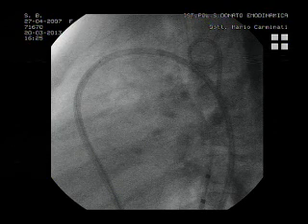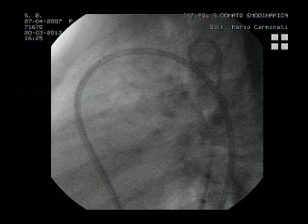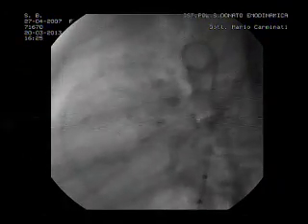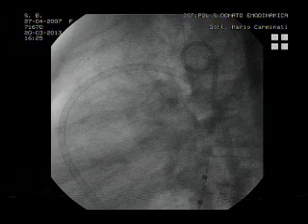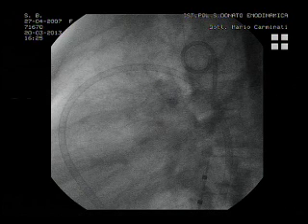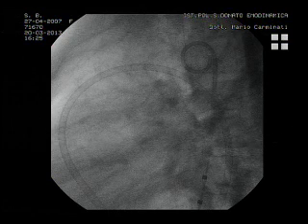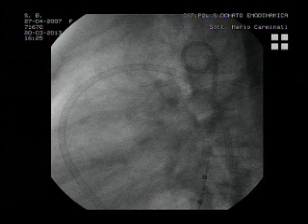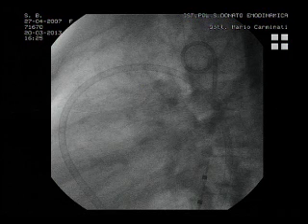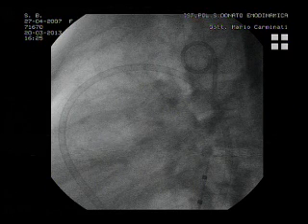Go ahead, Mario. Yeah, but the AVP2 is very similar to the Amplatzer vascular plug. Not very different. It is a vascular plug 2 that has one disc, one segment, and one disc. So basically, it is cylindrical because the discs and the cylinder in the middle are all the same diameter, but the wires that make the AVP2s are very, very soft compared to the ADOs, and it will adapt better to the configuration of that ductus. Can you see again the last angiogram we did here?